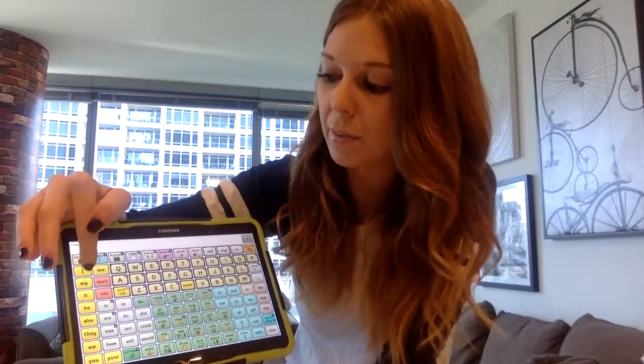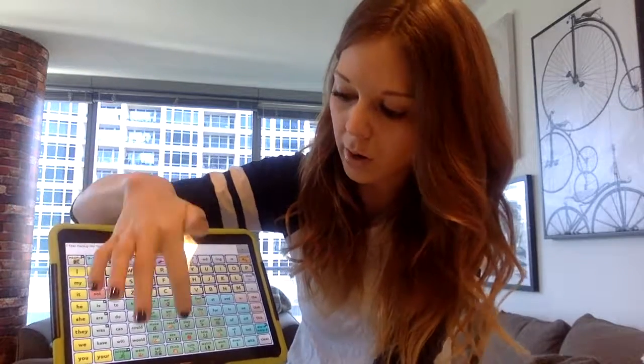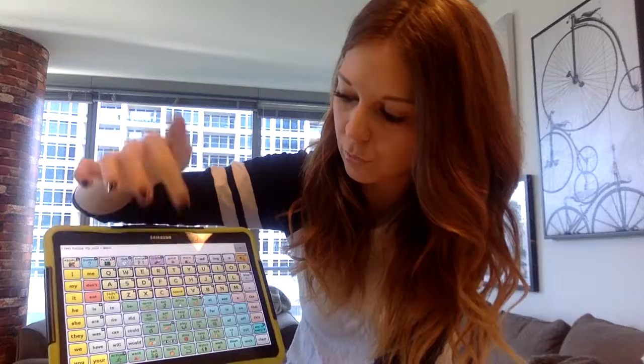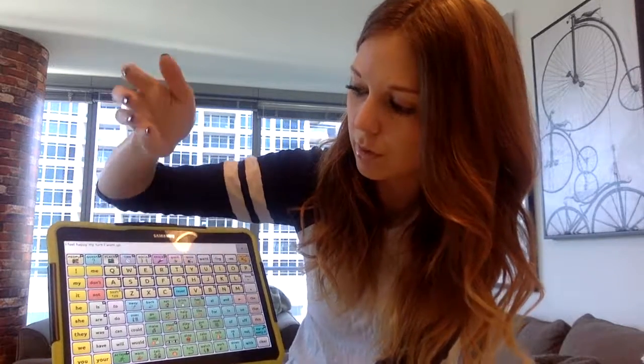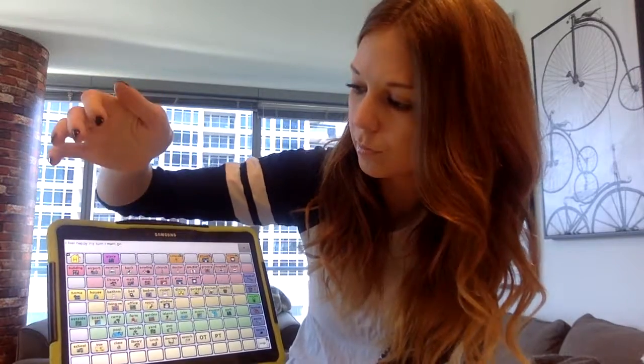So another thing about the Chat Editor computer software, there's a thing called capture mode. I can go in there and, on the computer, type out my turn, or I want to go into places. I want to go to the beach. So say one of your kids was working on a certain sequence.